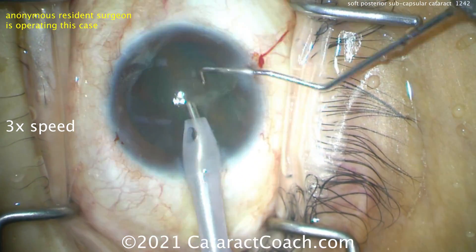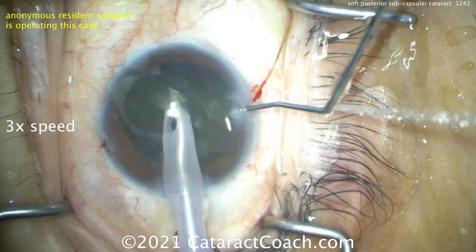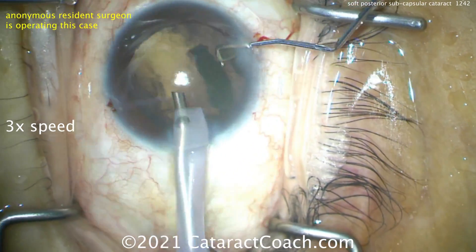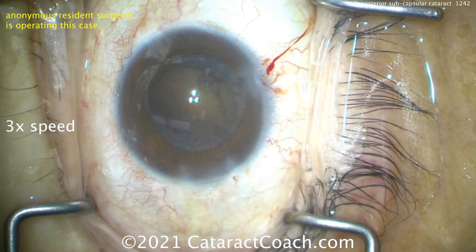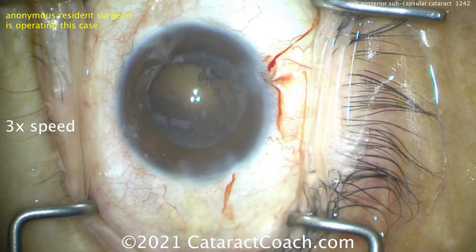When the cataract is on the soft side, not a lot of phaco energy is needed, not a lot of chopping is needed — we can just emulsify this down. This is actually the resident using the phaco probe, and this is the attending using the chopper, just to ensure things go smoothly. Very nice, coming out of the eye there.